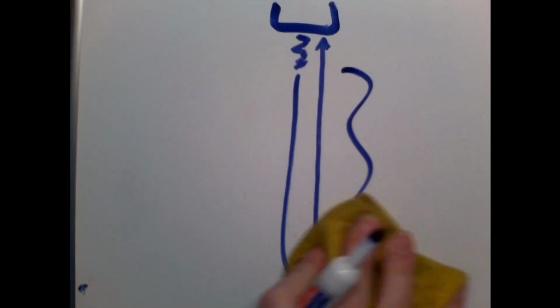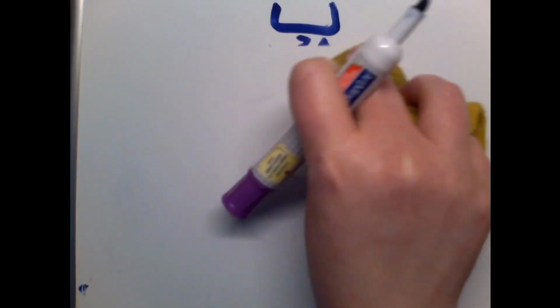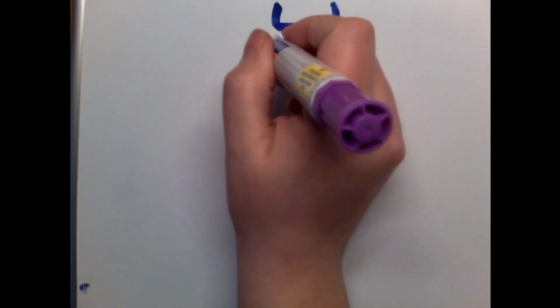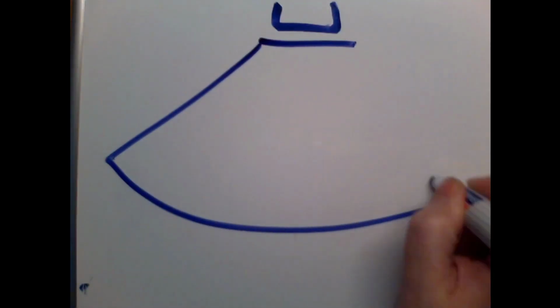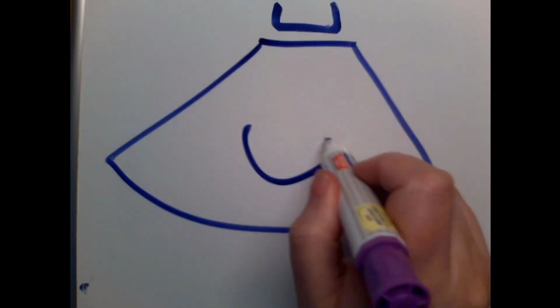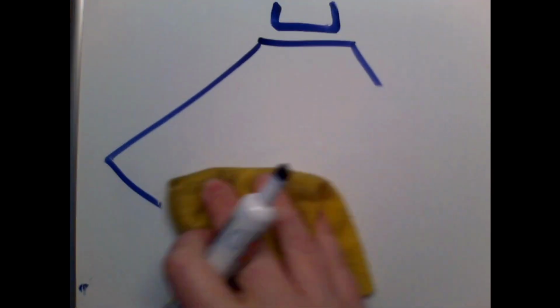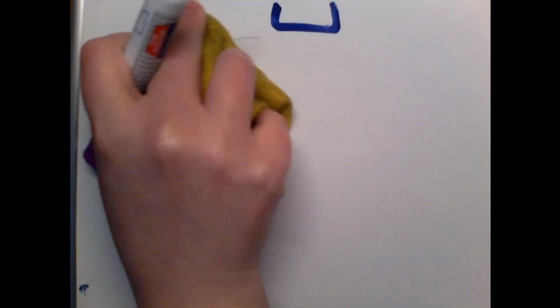Now the other idea behind these pulsed waves is that we use one pulse to create one scan line. And so when you think about your picture, we get this sector view to our picture, and our picture just shows up on the screen almost like magic, right? Not really. There's a lot of physics, there's a lot of things happening super quickly, like so quick our mind can't even keep track of it.